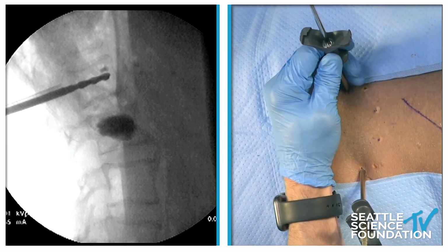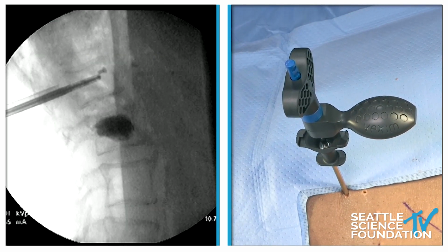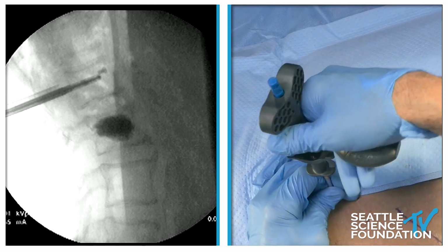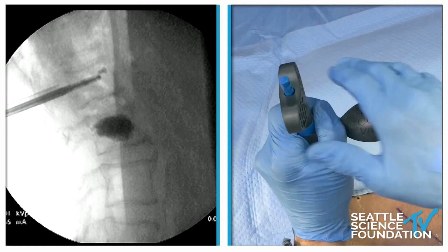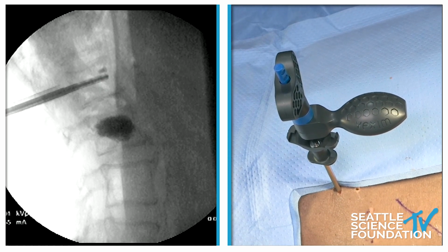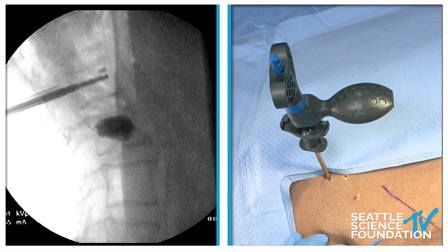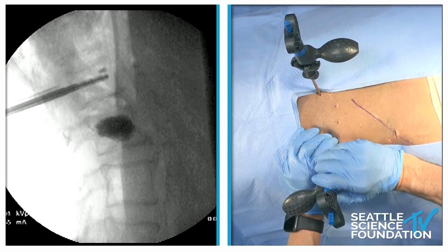So I'm going to go ahead and insert this in, and we'll see the jack in the lateral view here. I'm going to press it toward the anterior portion, about 3 to 5 millimeters from the anterior vertebral body. And I'm going to take the acrylic plug out. We'll put the other implant in. And I'm going to deploy the right side.